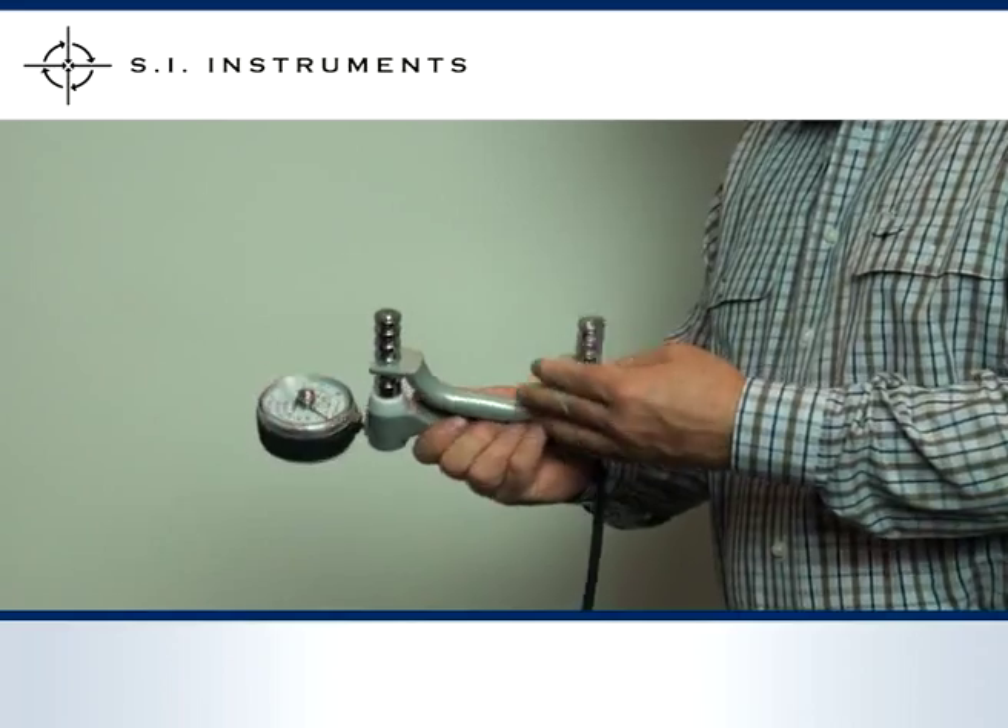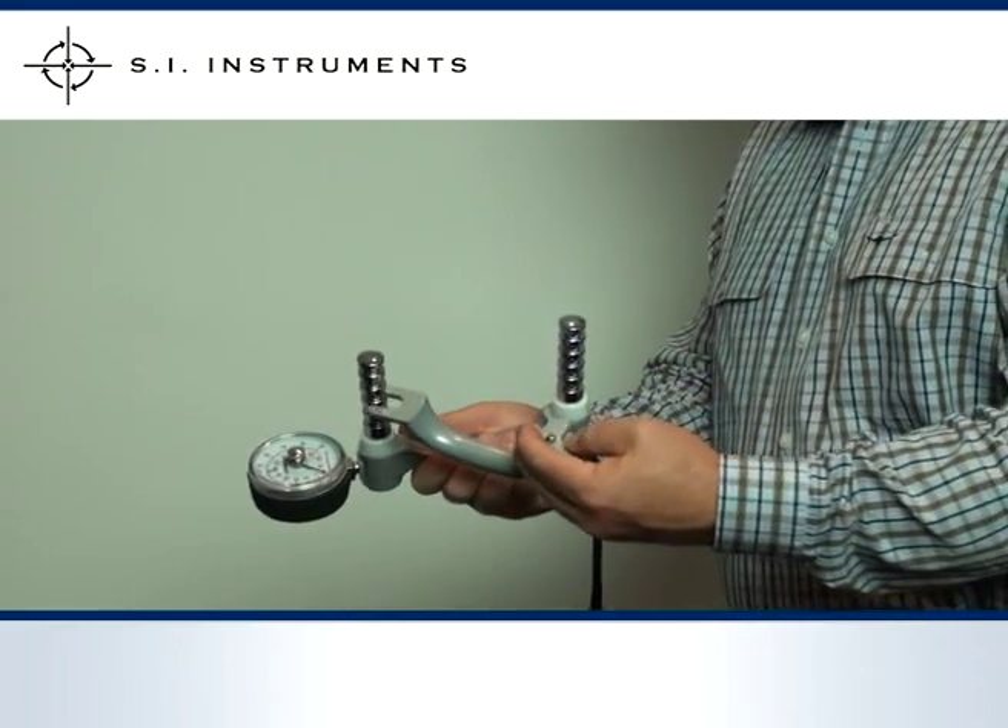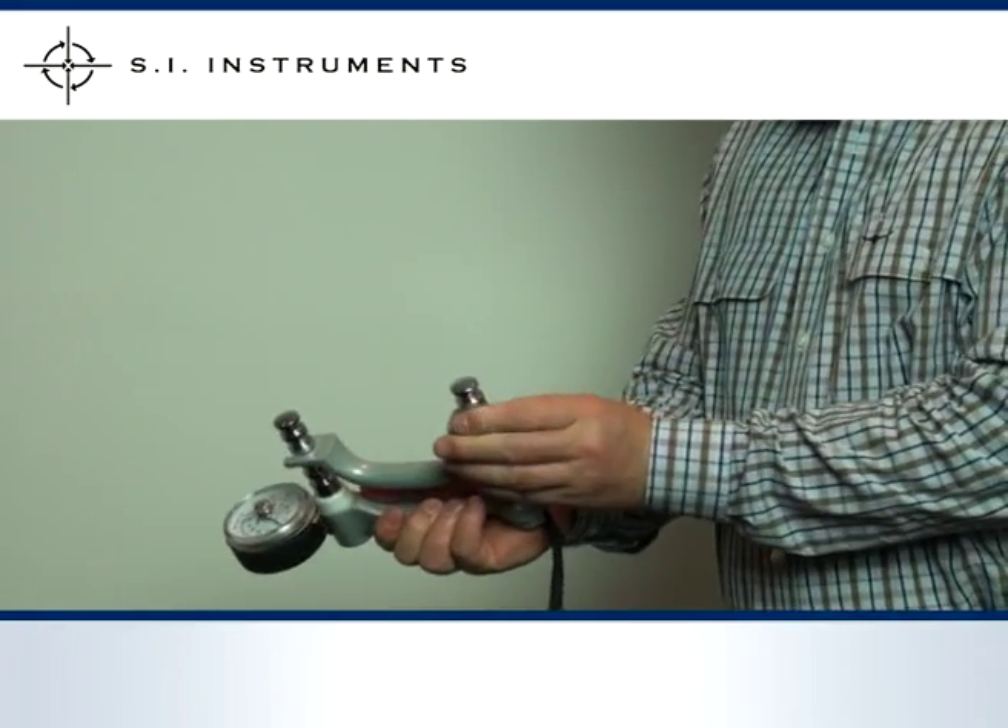The handle can be adjusted by removing the position lock at the bottom. Readjust and again lock in place using the position lock.